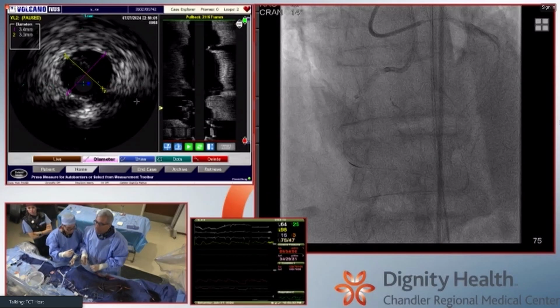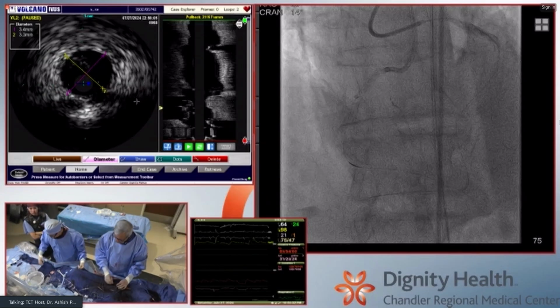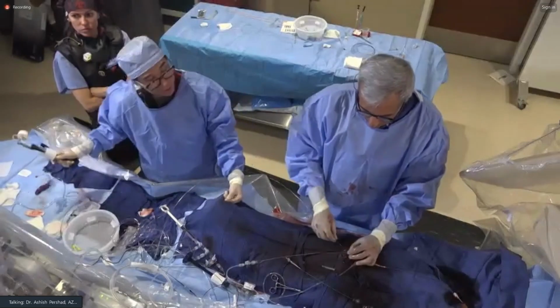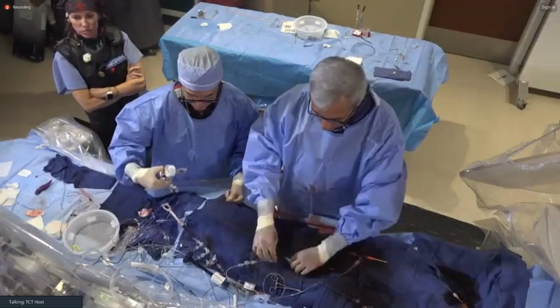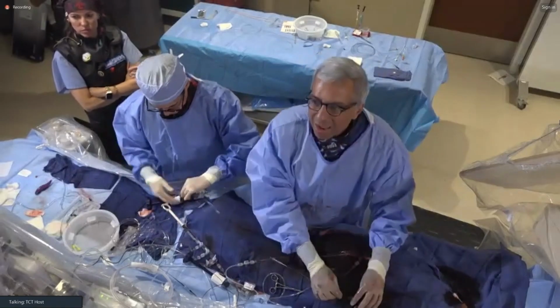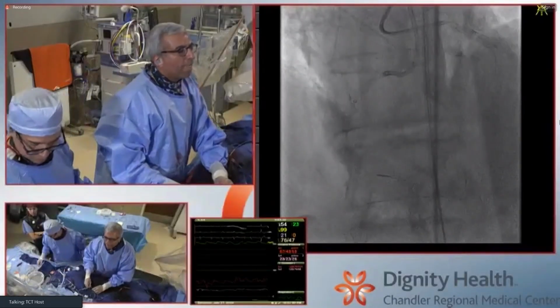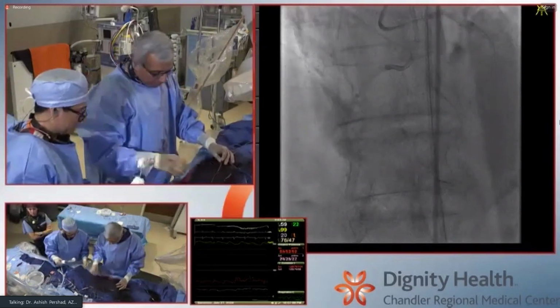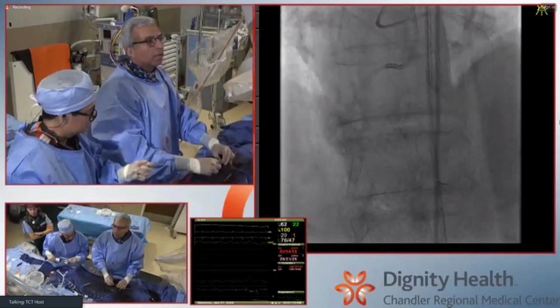Sanjog, while they're working on it, do you want to comment on the IVUS images? Just for the audience, part of it is subintimal, part of it is intraplaque, etc. You've seen the 180-degree calcium. How does the IVUS image in general help you, specifically from a calcium standpoint? There was a question asked about IVL. What's your strategy? We talked about rotational atherectomy necessity. Do you test with an NC balloon, cutting balloon, IVL? You have a lot of options now.